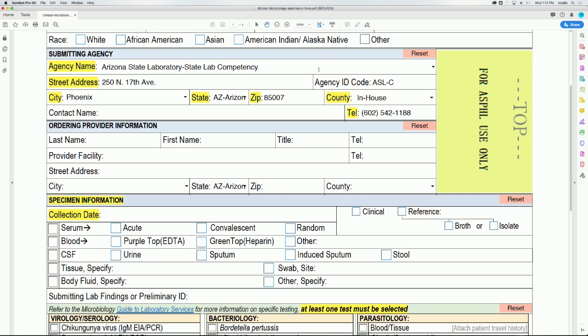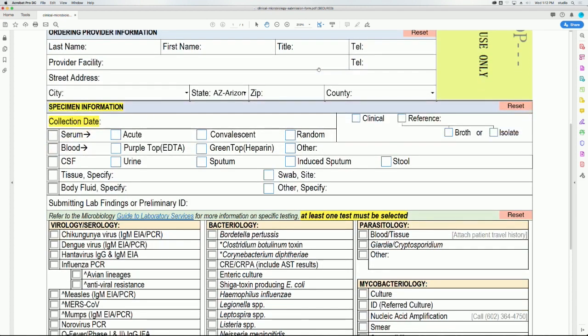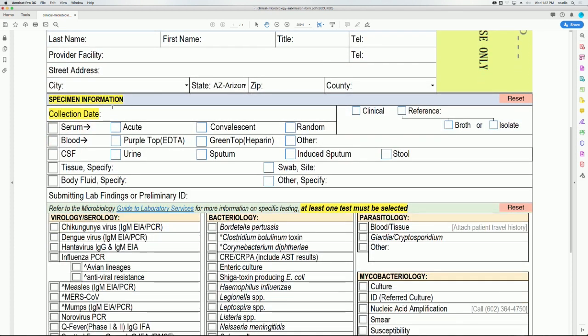The last section of the form is labeled specimen information. The collection date, type of specimen slash source, and the test request are required for submission and testing. When filling out the collection date, use the month backslash date backslash four digit year format or select the date from the calendar using the drop down arrow.